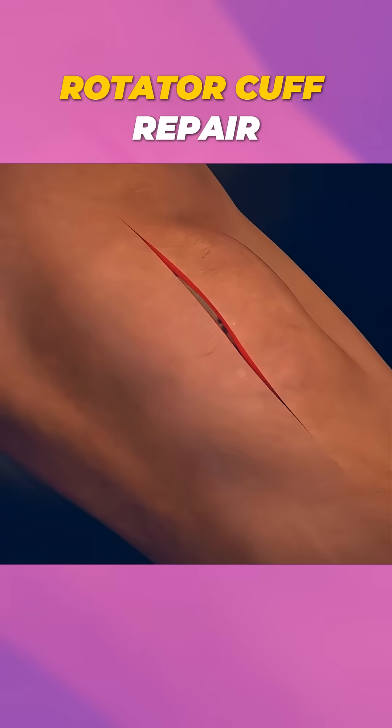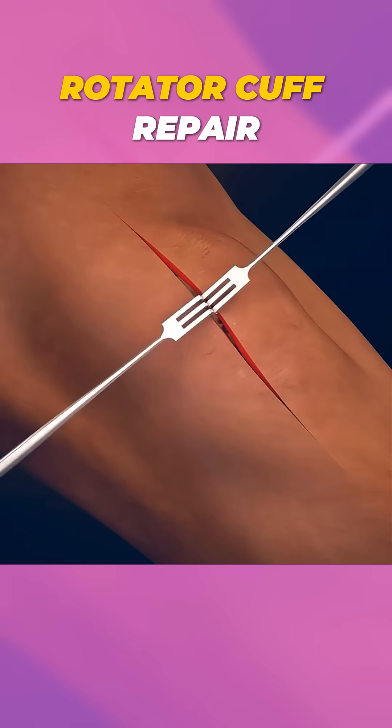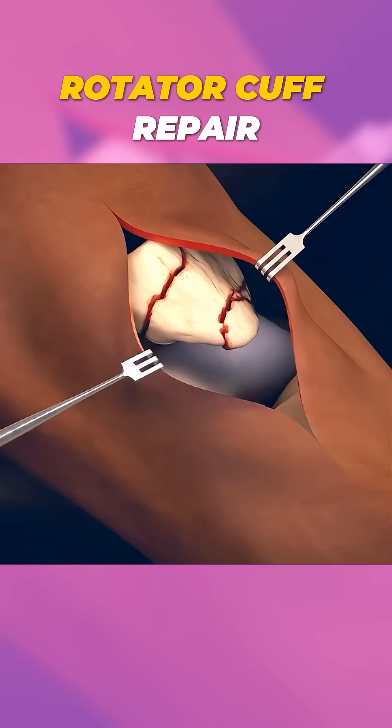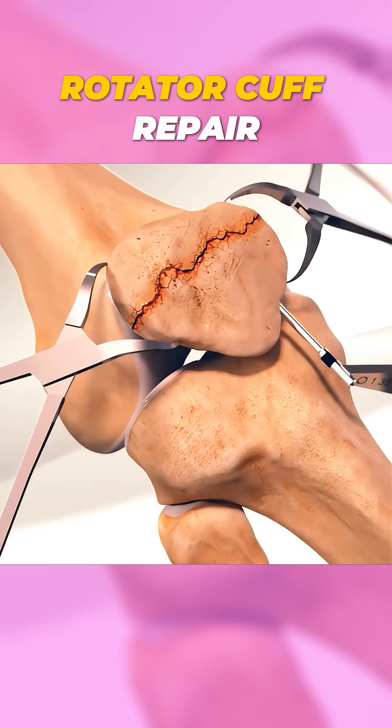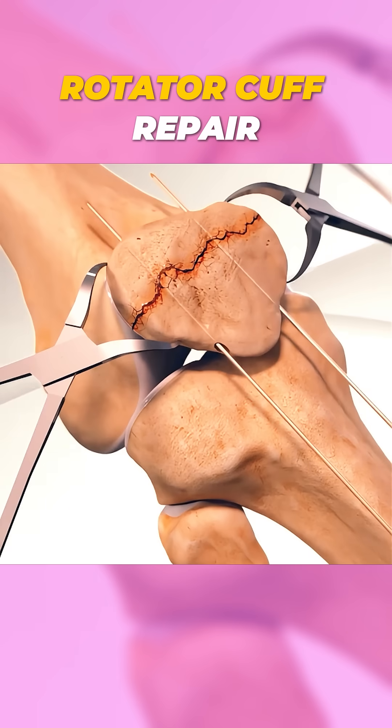The procedure typically begins with the surgeon making an incision over the knee to access the broken fragments. Using specialized tools, the pieces are carefully aligned to restore the natural shape of the patella.